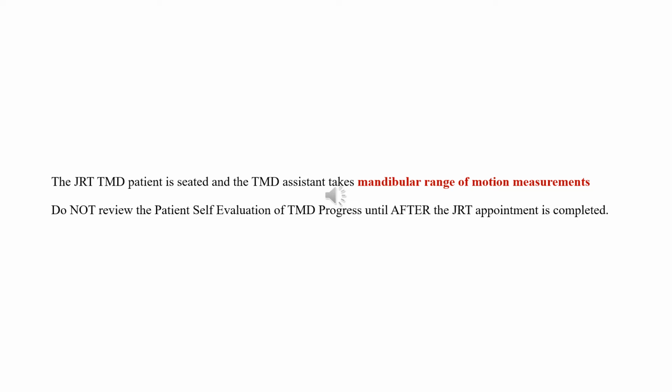Patient starts making complaints about the soft guard. That is not the real appliance. Many of these complaints will be taken care of with the hard Mora. And so we want to get that Mora made. That's what the patient really wants us to do, but they don't know that yet. But you need to just be sure that you don't get mucked up in patient complaints, because we want that Mora in as soon as possible.